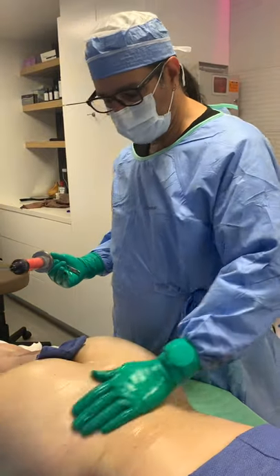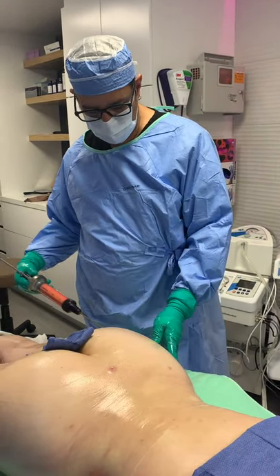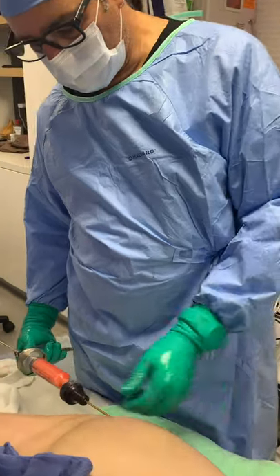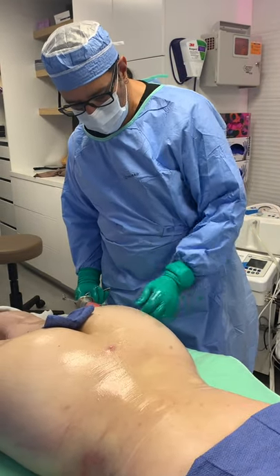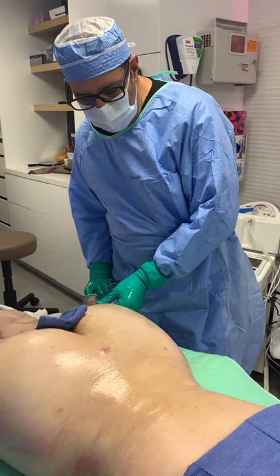Dr. Torres again. We're about to start a fat transfer on this girl. We've numbed her up. We've done her entire case already. And you can see how nice her waist came out. And so now we're just gonna give her projection.